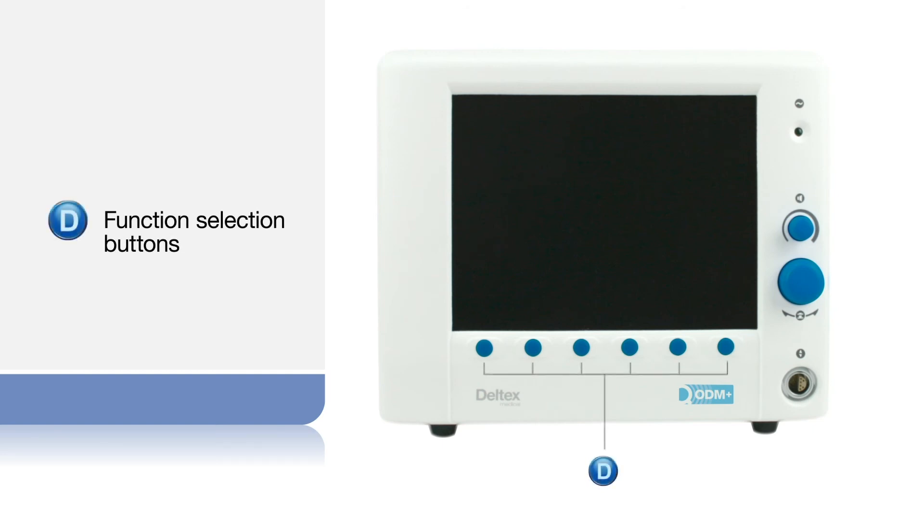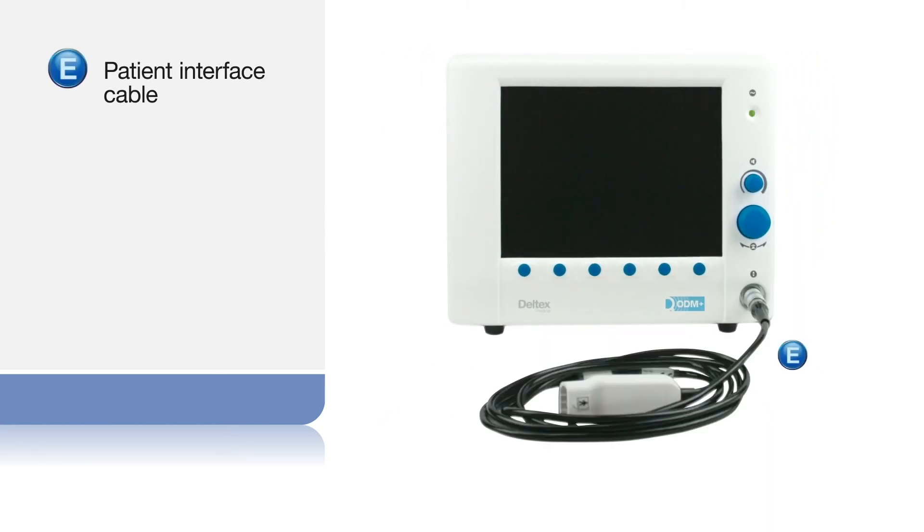Six buttons are used to select the functions displayed along the base of the screen. The socket for the patient interface cable.